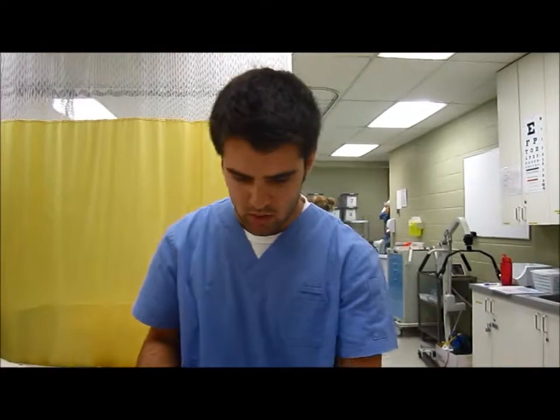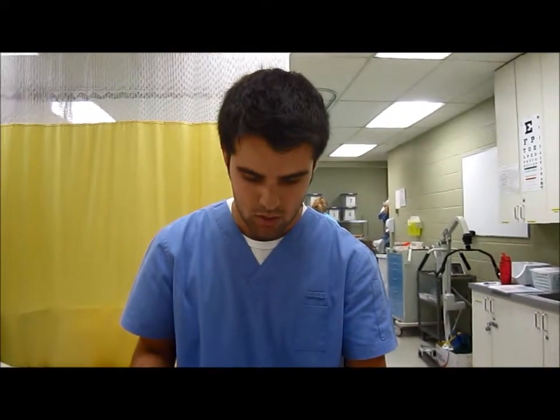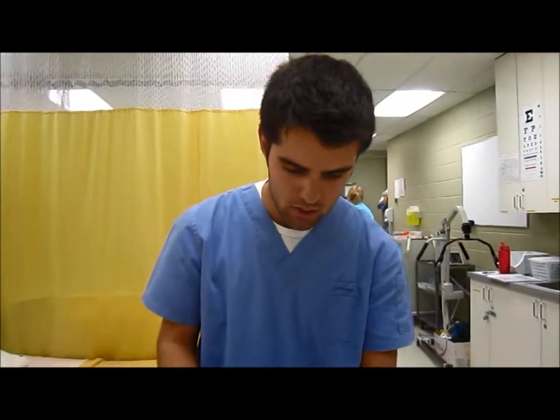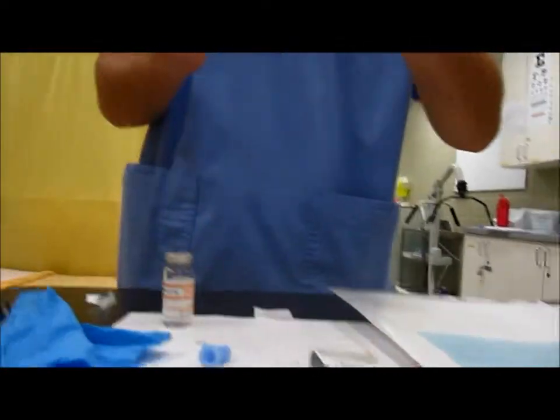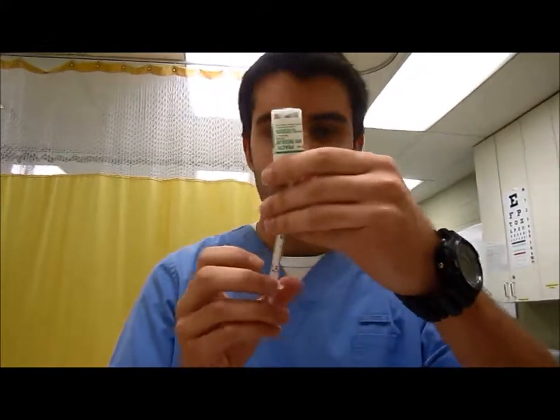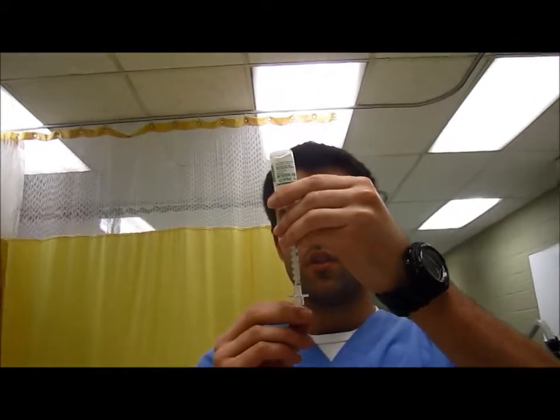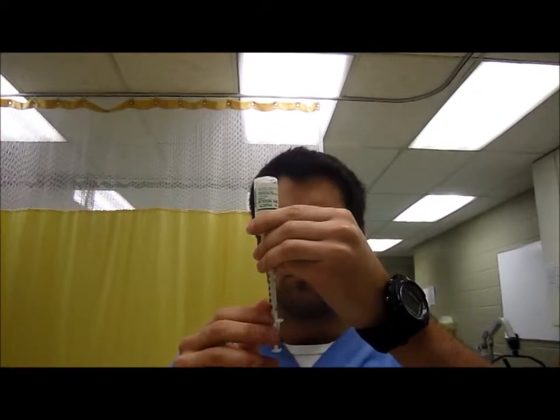And then I would swab it again and withdraw 16 units. So in total, there should be 20 units of insulin in here. Okay.